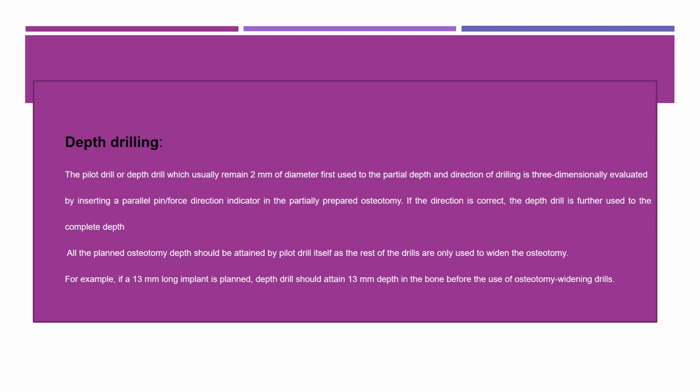After the initial drill, you have to place your parallel pin and you can take the radiograph. The parallel pin should always be engaged with the forceps so that it will not be swallowed or misplaced while taking the radiograph. So that is the pin forceps.